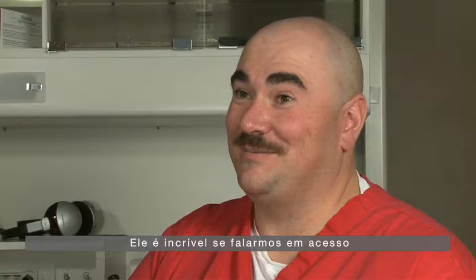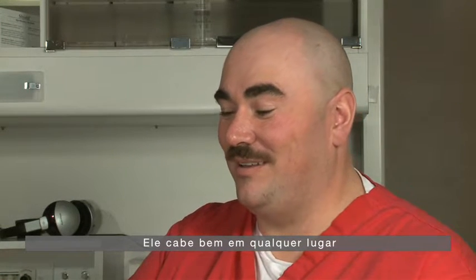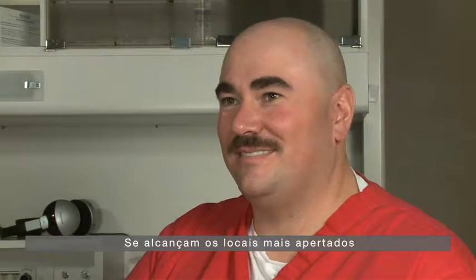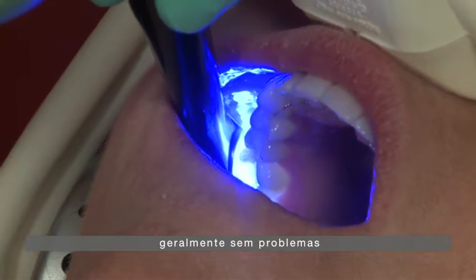The Velo is awesome when it comes to access. It fits pretty well anywhere. That head is so small and nice — we can get it into the smallest, tightest little corner usually with no problem.